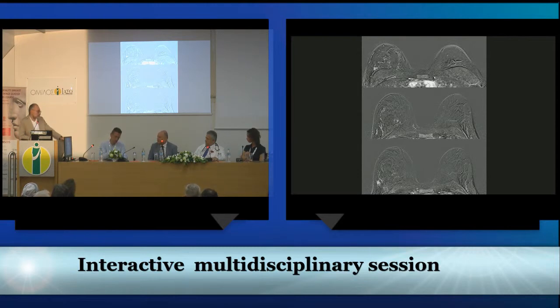That really depends on the patient's width, the size of the breast.